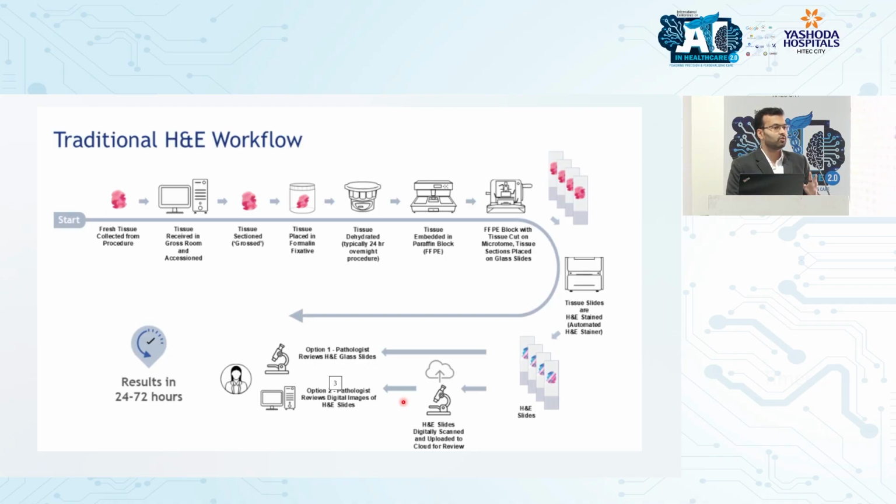Suppose I give you time and you have only one case to report in the entire day. You will definitely go and look at the gross image, you will look at the sections, you will see the block surface. Finally, you will give an accurate report. Suppose we give you all that information on one screen. It's not like we don't want to see the information, it's just that we don't have the time to see it for every single section. But if it's provided to us, then it obviously improves our accuracy.